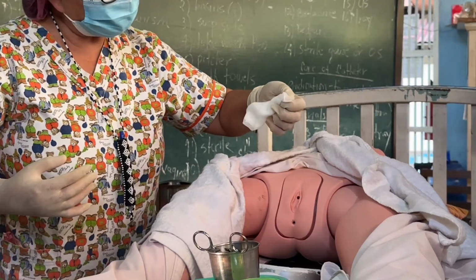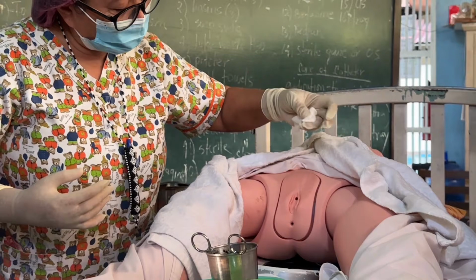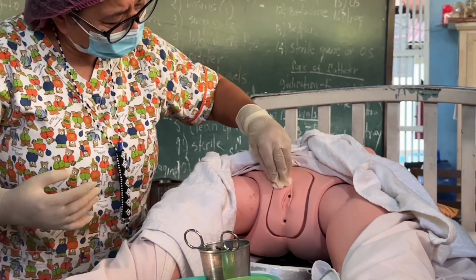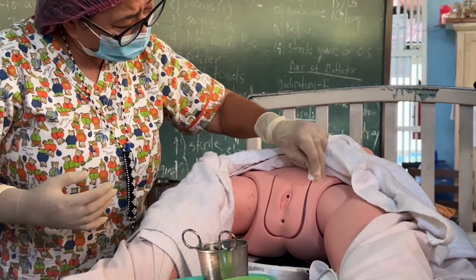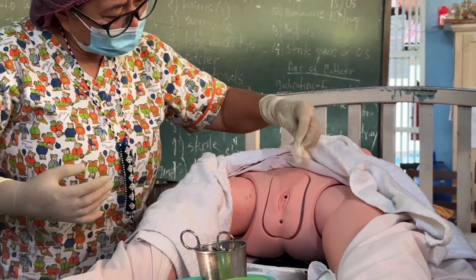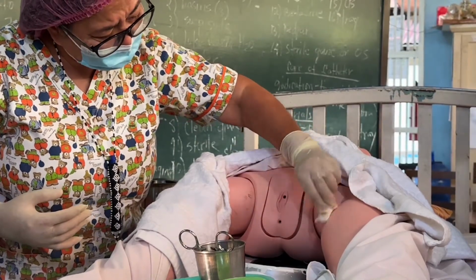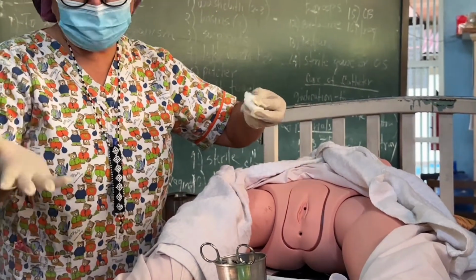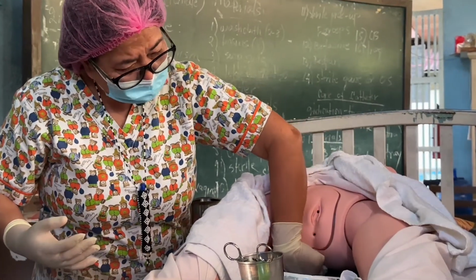Okay, you can turn or you can use another pads, sterile pads if you have plenty. Then you go now to the farthest labia majora, pat dry, nearest labia majora. Then mons pubis, zigzag stroke going up. And then farthest groin, nearest groin, farthest inner thigh, zigzag stroke, nearest inner thigh, zigzag stroke. Then another OS, then anus, buttocks, gluteal folds last.